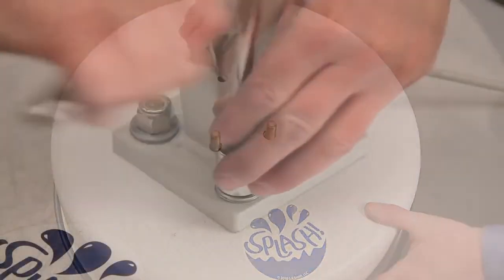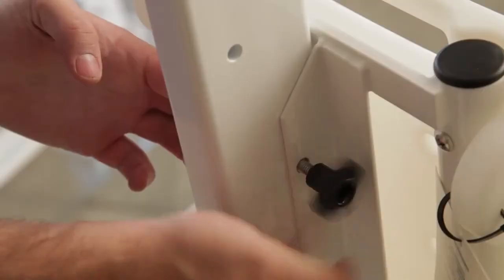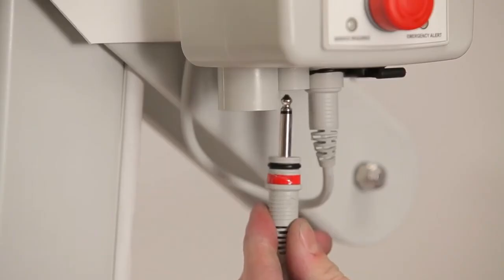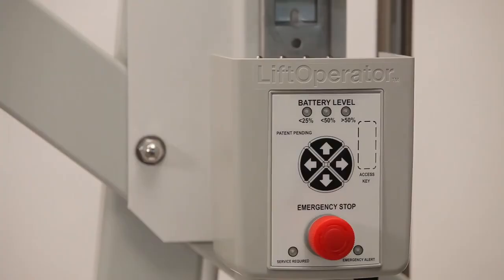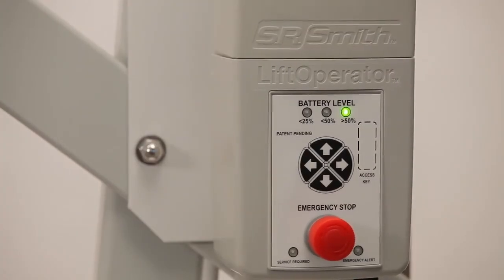on the lift. Replace the mast assembly, reattach the seat assembly, and reconnect all of the cables to the control box, making sure they are plugged in securely, and then reinstall the battery.